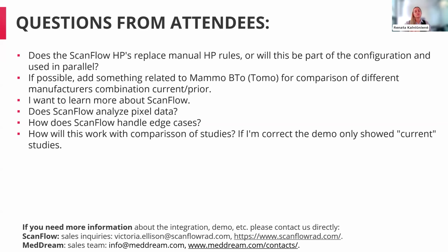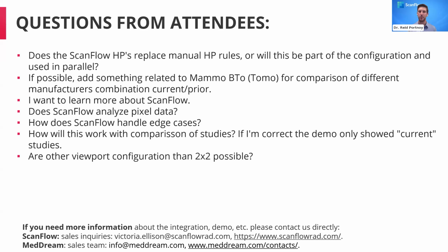Okay, thank you. I'm going to read the second question. If possible, add something related to mammo, tomo for comparison of different manufacturers' combination current prior. Yes, as stated earlier in the demonstration, ScanFlow works well with all sorts of imaging modality from X-ray, ultrasound, MRI, tomosynthesis, mammogram, regarding comparisons as well, and different manufacturers.